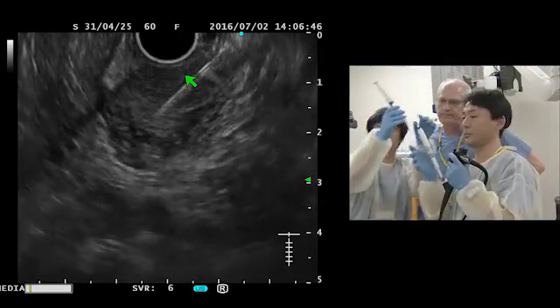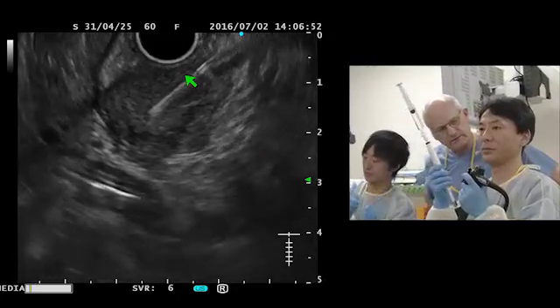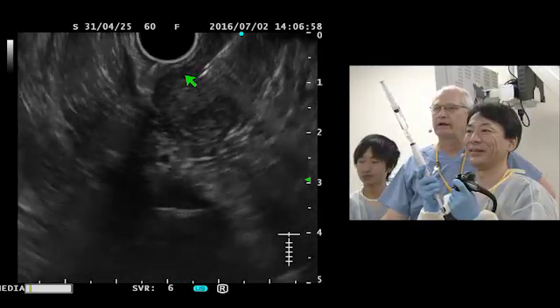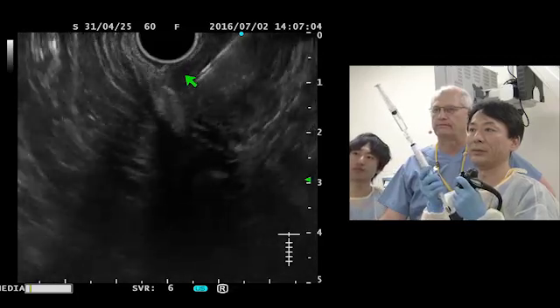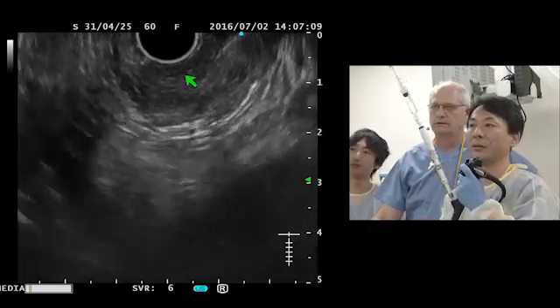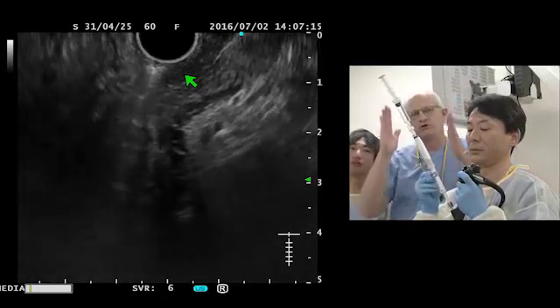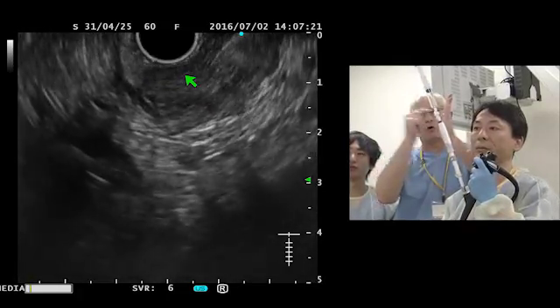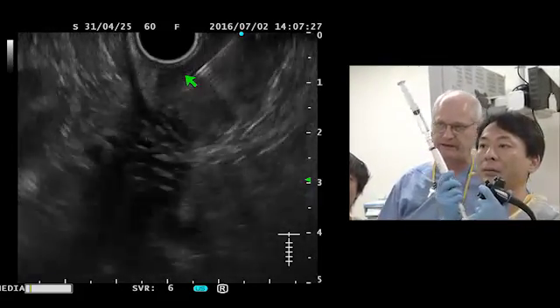So now we will put suction, and you will use the fanning technique. I hope. I try. Okay, so withdraw, and then a fast puncture in. So adjust the scope, fast puncture in. You should go from each end of the lesion to the other. So between my hands, you should go all the way. The longer the distance, the better the specimen, I think.